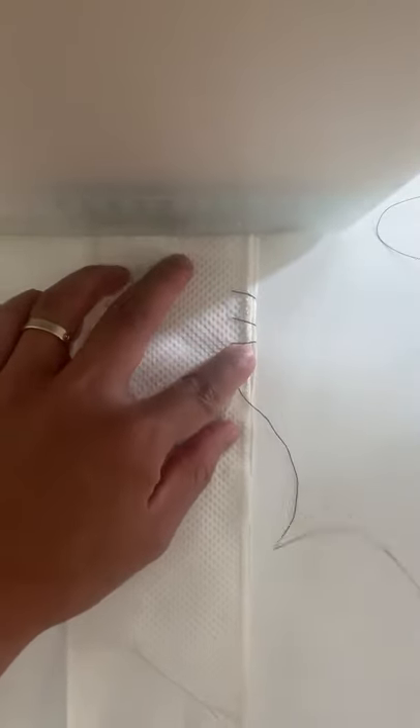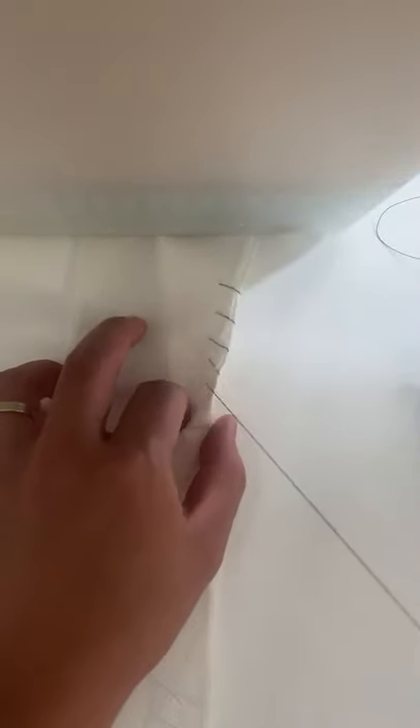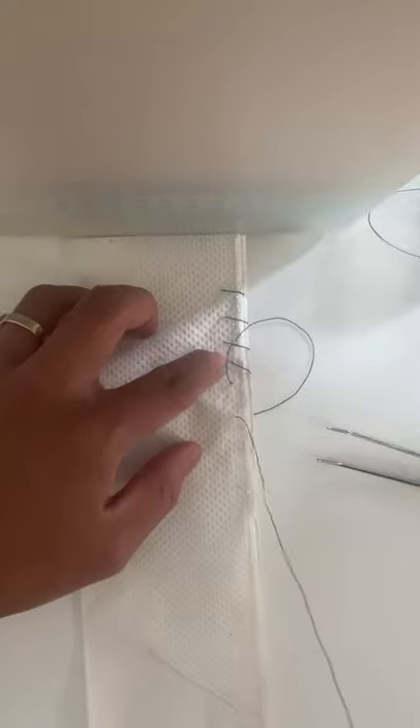Sometimes they call this a baseball stitch because it has the resemblance of the stitch on a baseball. So it's continuous — we're not going to stop until we complete our closure. Let's do one more. Okay, we have one, two, three, four stitches in.